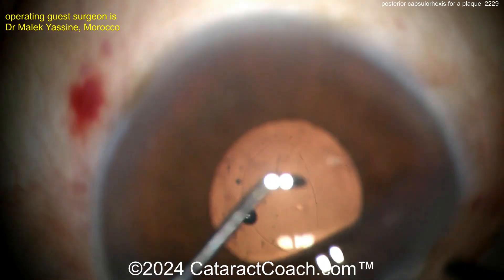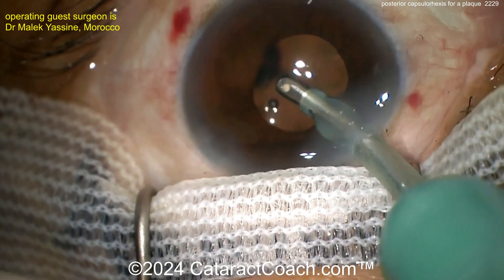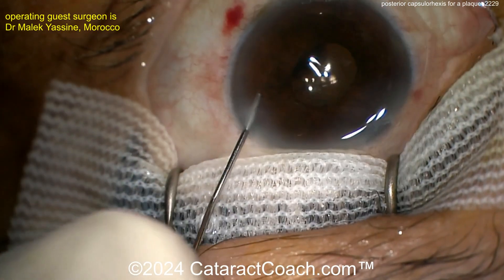I like to inject more viscoelastic dispersive agent along the anterior hyaloid face behind the posterior capsule, just a little bit, just to create a barrier. There you go — nice-looking rexis. Beautifully done. End of the case. Seal up the incisions — beautifully done. The patient's going to have a beautiful outcome.